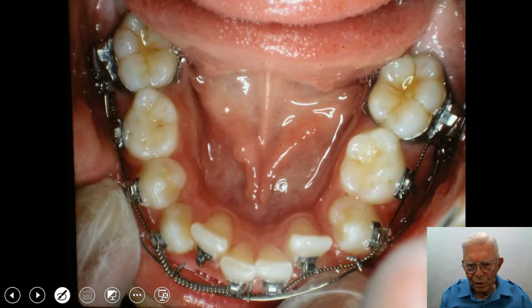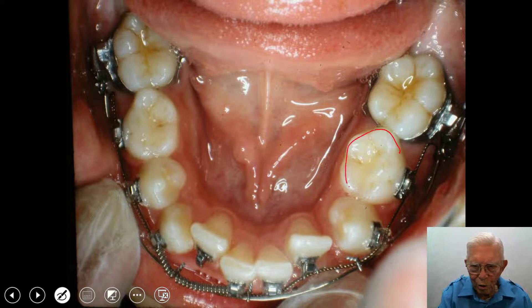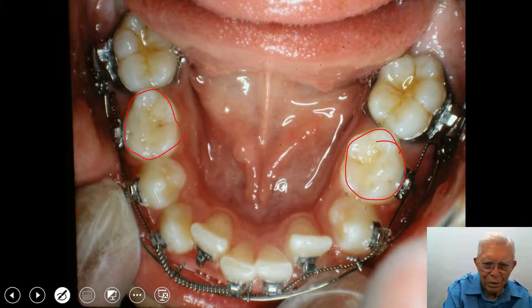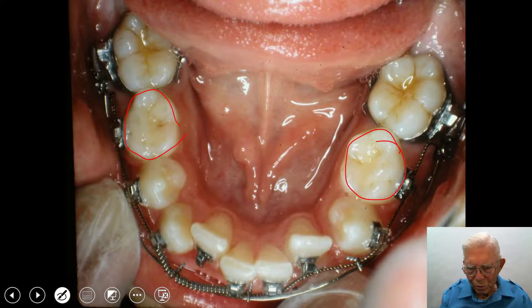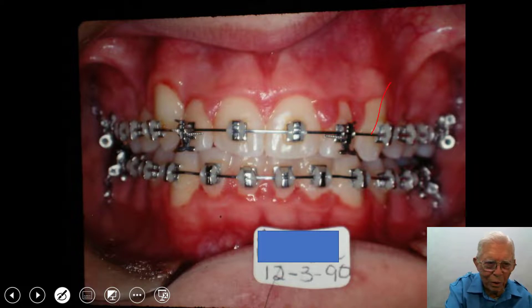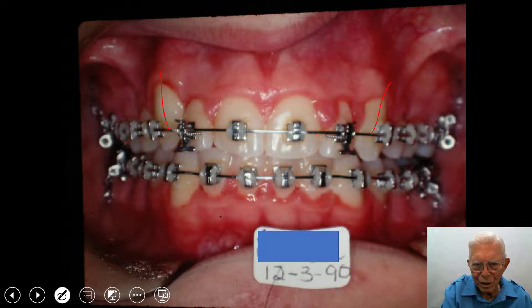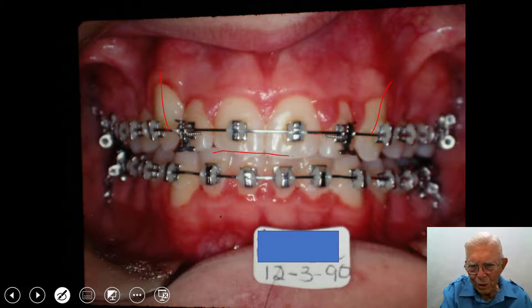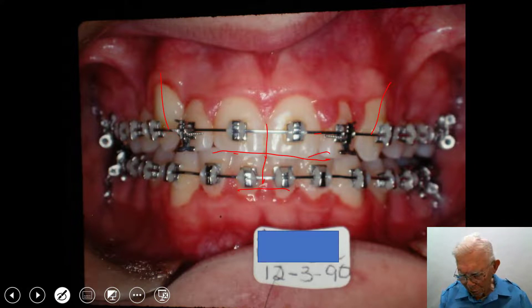The deciduous second molars are in place here, and this is a long time after they should be out, so we're going to have to look at that from the x-rays. This young man is pretty serious-minded. This is lined up in the front now — we're doing real good. We've got these bicuspids coming in and this is leveled out. The bite is open now. The upper teeth that went down and the bottom teeth went down, these went up, and it's lined up quite well at this point.